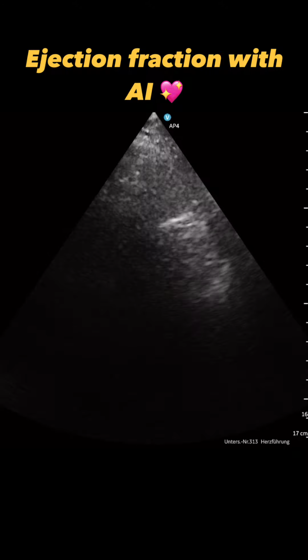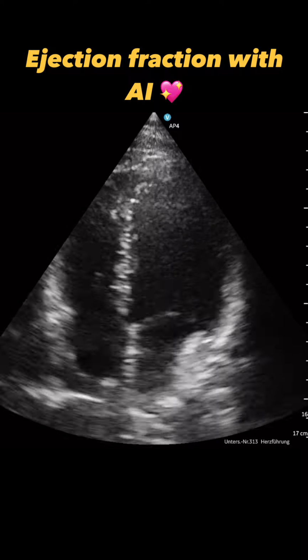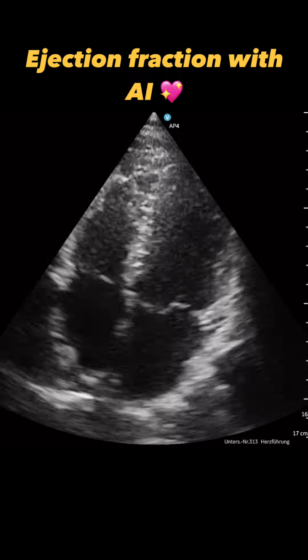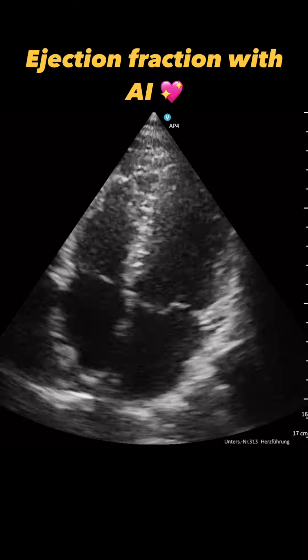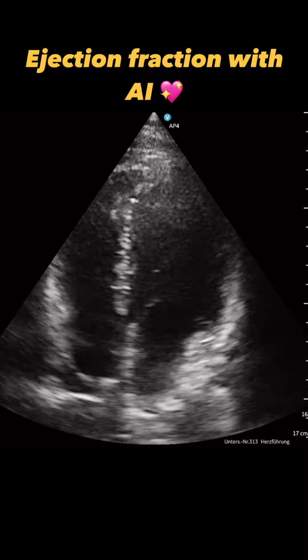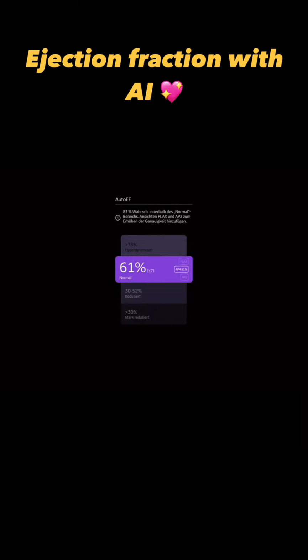This was an example where the AI said this is definitely not a good view, this cannot be used for calculation, which is absolutely correct. And with this optimized four-chamber view, the two-chamber view, the parasternal long axis view, it gives you an estimate of ejection fraction and also an estimate of the likelihood of where the normal ejection fraction is.